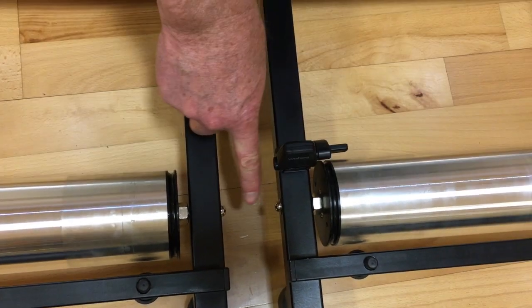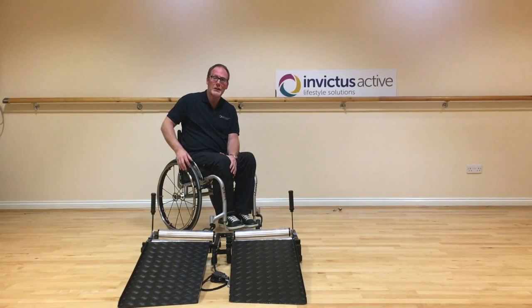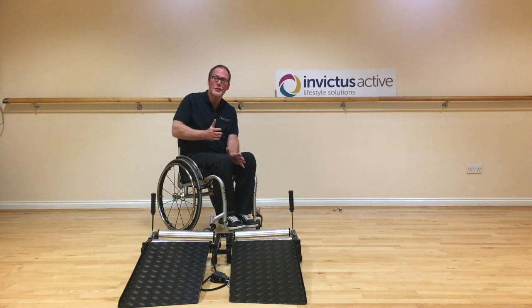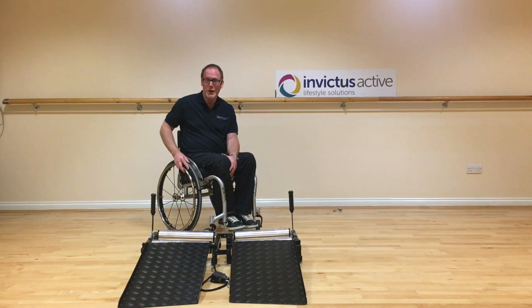So if the trainer is set up square, what's the reason you travel left or right during your workout? There are a few reasons. The first thing is to check your tyre pressure - if one tyre is at a different pressure to the other and there's a significant difference, this can cause you to travel left or right. The other reason is tyre wear. If you look at your tyres and they're both at the same tyre pressure but one has excessive wear, that can cause travel.